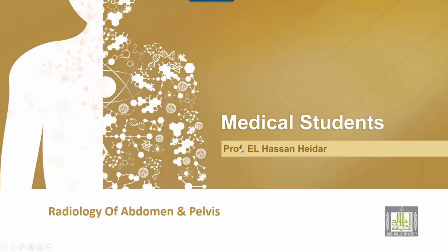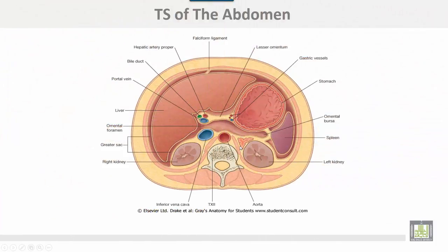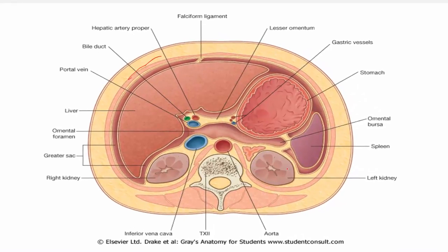Radiology of the abdomen and pelvis. This is a transverse section in the abdomen showing the spleen on the left side, the stomach, the liver on the right side, and kidneys on both sides.